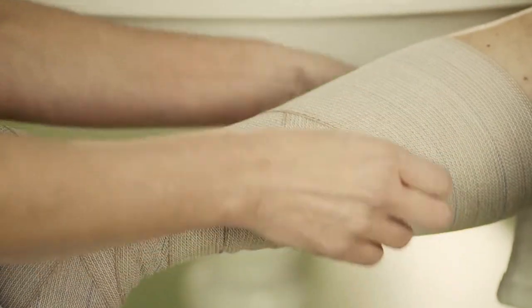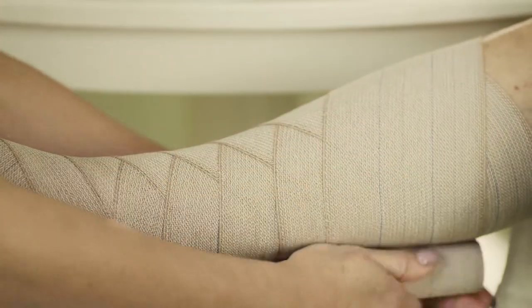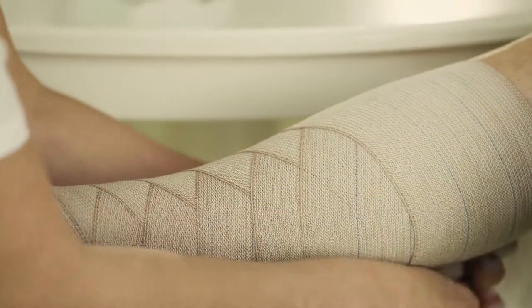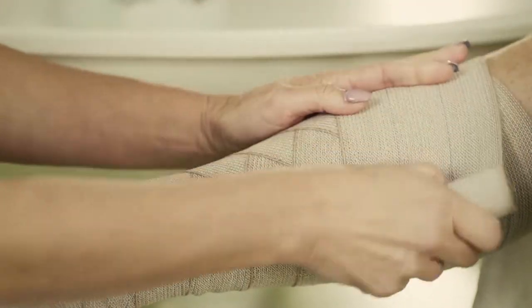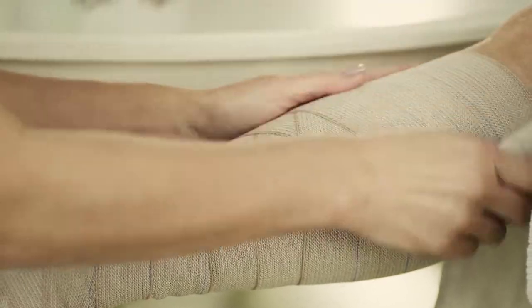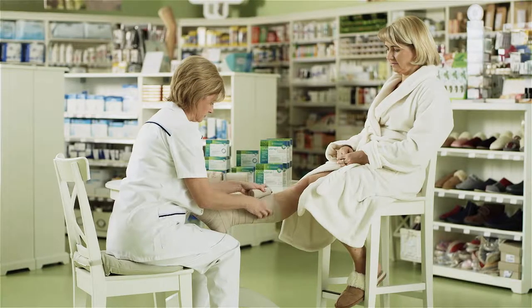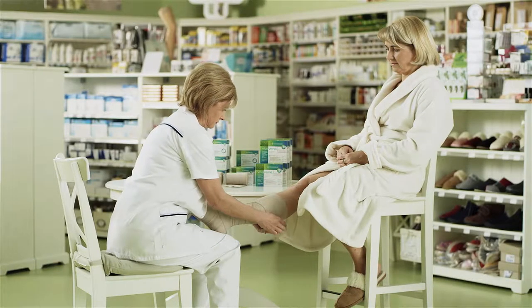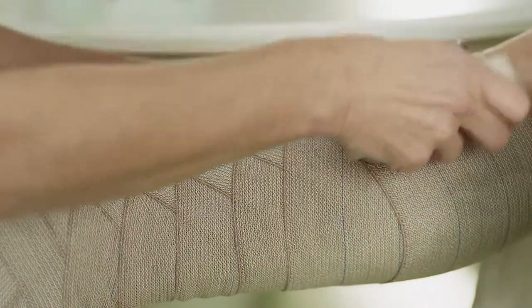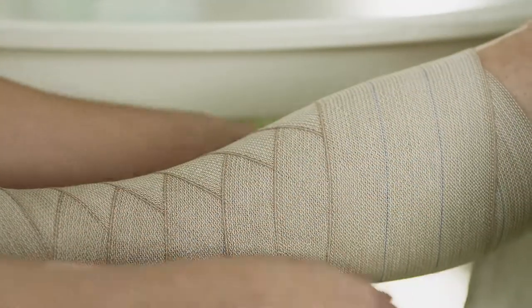If the shin is of a cylindrical shape, the ankle diameter is approximately the same as the diameter below the knee. The pressure just next to the toes and the lower part of the shin should be greater, lessening upwards. The leg should be evenly wrapped up to the kneecap. If the bandage is properly put on, the blue lines are not visible.